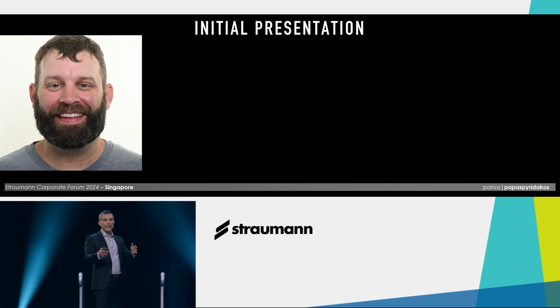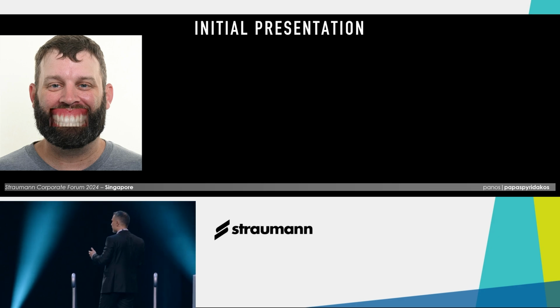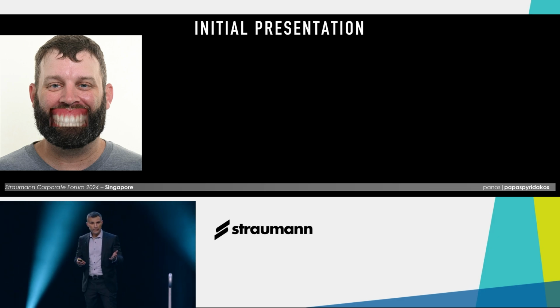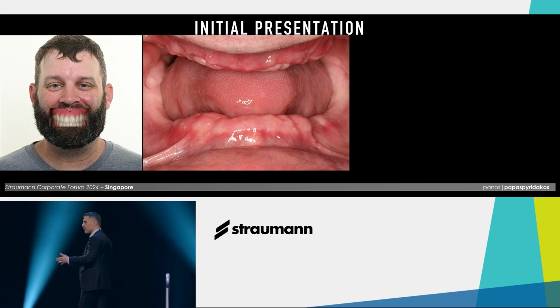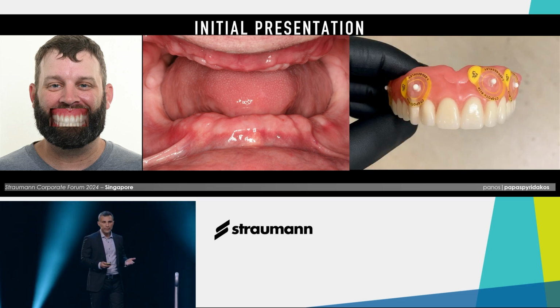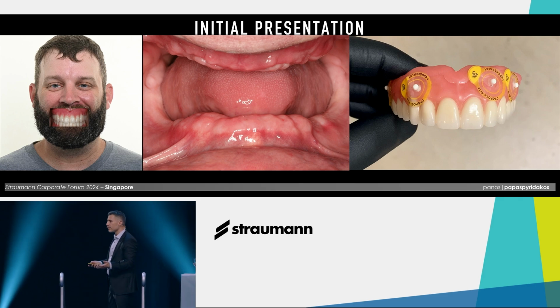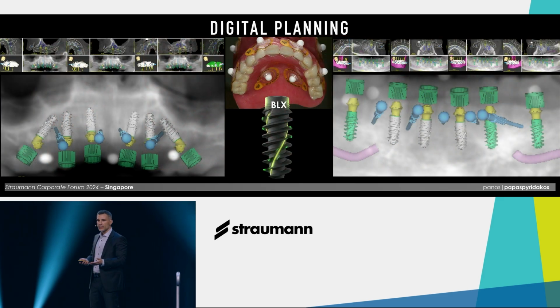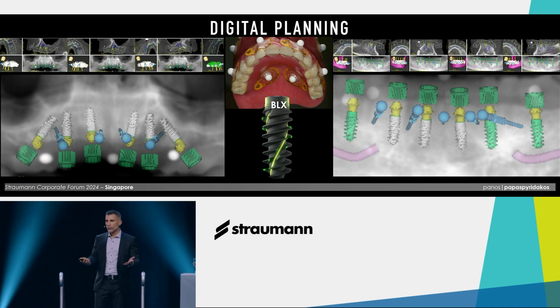So the patient of the day will be Gary. Gary is an edentulous patient. He came to the practice with a set of complete dentures, seeking fixed rehabilitation. So what do we do? The first thing is we assess the existing set of dentures. It satisfied the aesthetic, functional, and phonetic requirements, so we convert it into a radiographic template. We did the dual CBCT scan technique and imported the generated DICOM files into a virtual planning software, coDiagnostiX.